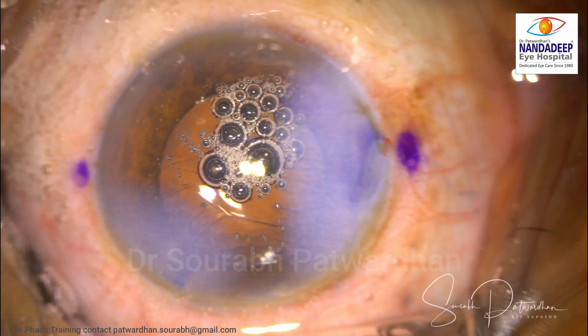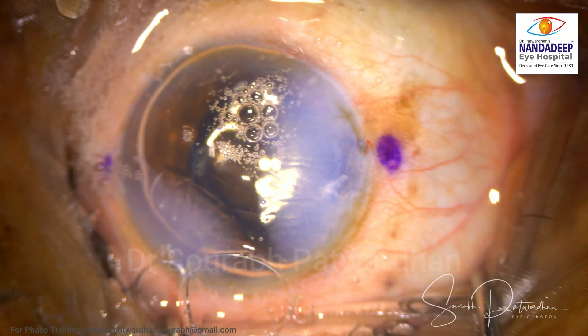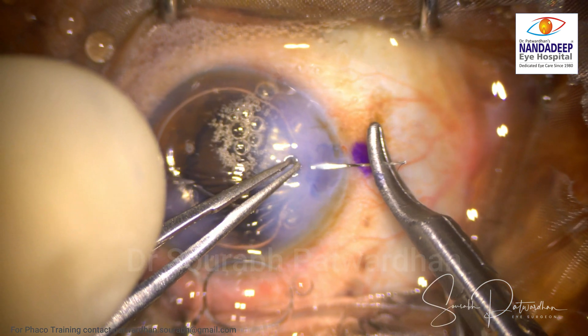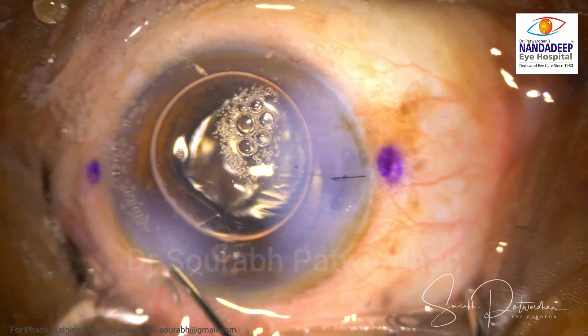Something is different, and this is the time when I realized there is a profuse wound leak. The reason could be the wound burn. As I injected air into the anterior chamber, I can see the air bubble going into that small channel, which was indicating tissue loss — or I would say tissue shrinkage — which had happened in the area of corneal wound burn. I now realized I am dealing with wound burn, which is shrinkage of the collagen because of the heat dissipated from the phaco needle.